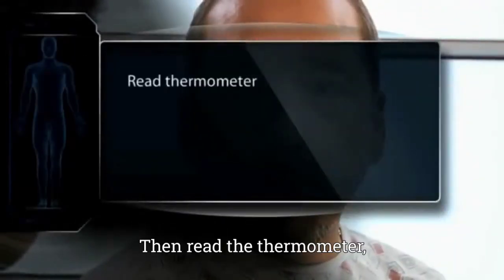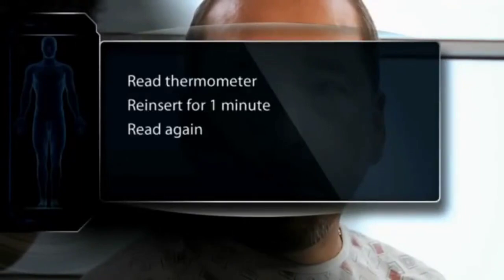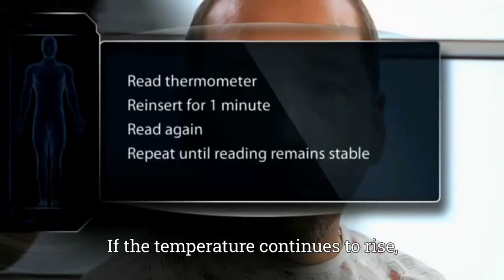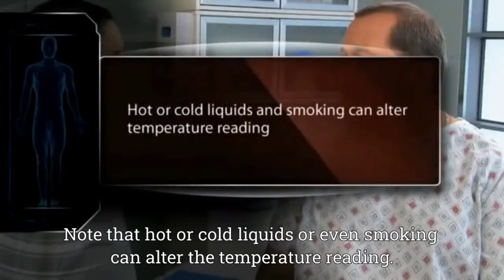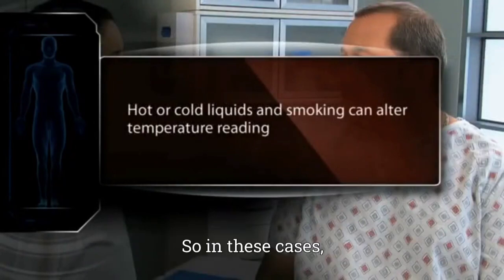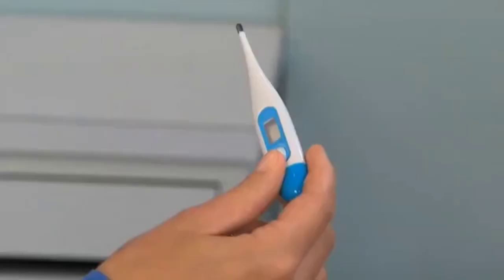Then read the thermometer, reinsert it for 1 minute, and read it again. If the temperature continues to rise, repeat the procedure until the reading remains stable. Note that hot or cold liquids, or even smoking, can alter the temperature reading, so in these cases, it is best to delay measuring the temperature for 10 to 15 minutes.